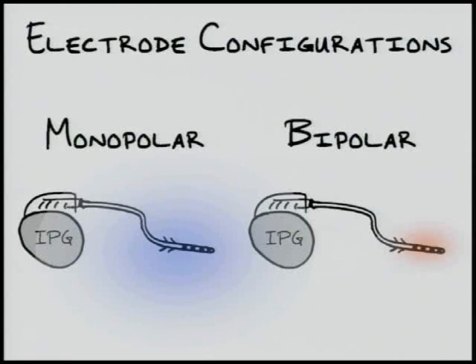Bipolar stimulation provides the ability to more precisely control the area within which nerves will be excited by stimulation. Generally, only nerves near the lead will be stimulated with this configuration. Again, a bipolar stimulation setup enables more specific stimulation of target nerves, reducing excitation of other nearby neurons by confining the area within which neurostimulation excites.